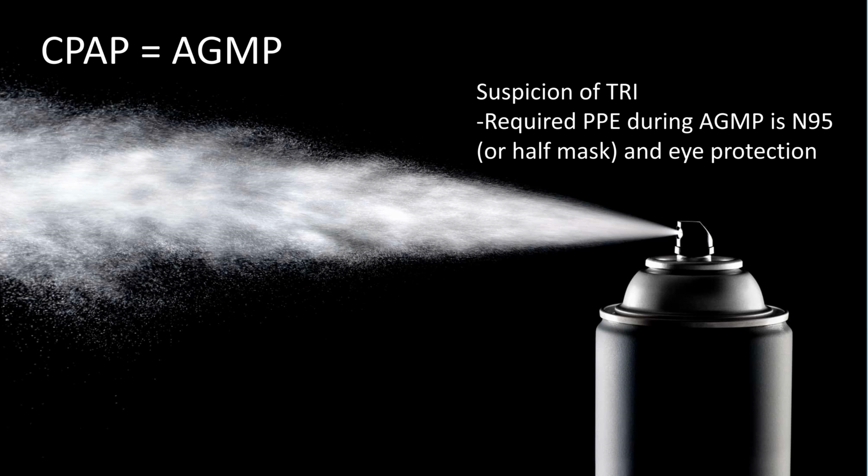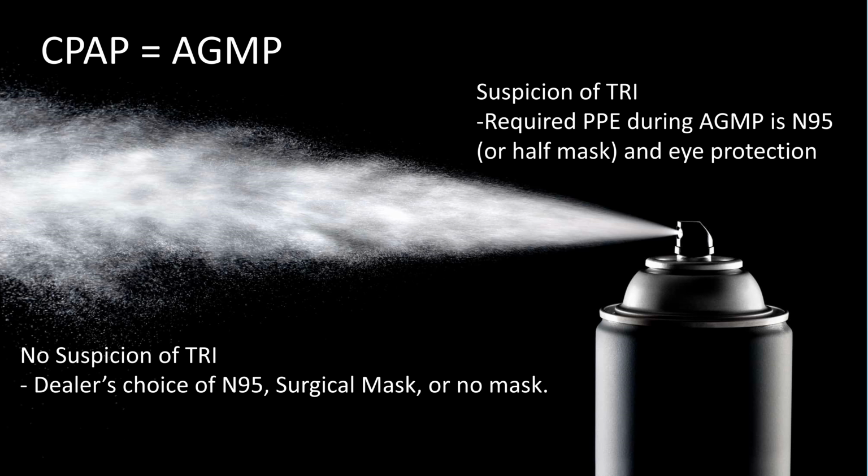If you believe your patient is symptomatic of a more chronic respiratory condition as opposed to a transmittable illness, you may choose to wear an N95, a surgical mask, or no mask while delivering an AGMP intervention. This is obviously dependent on the clinical situation, with a continued emphasis on protecting yourself. This document has been updated to reflect the recent changes in routine practices with Shared Health, with an emphasis on point of care risk assessment.